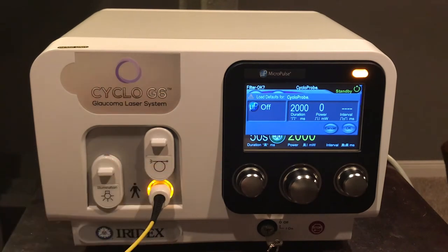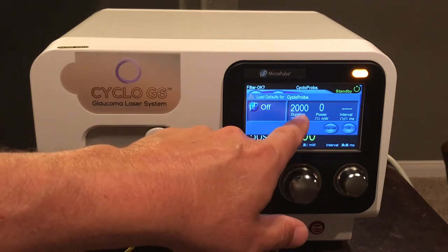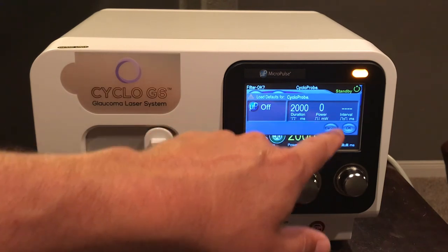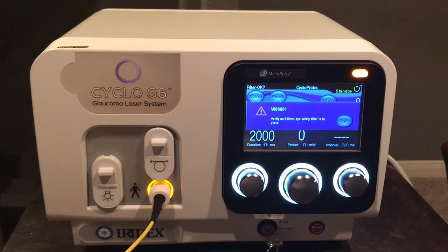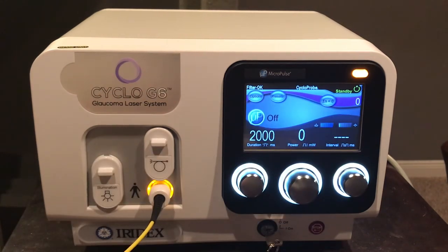On screen, we see continuous wave mode is active — micropulse is off — with duration set to two seconds (2000 milliseconds) and power not yet set. Pressing OK, the system will verify that all personnel have their 810 nanometer eye safety filter goggles in place. Once confirmed, press OK again and you are ready to treat.